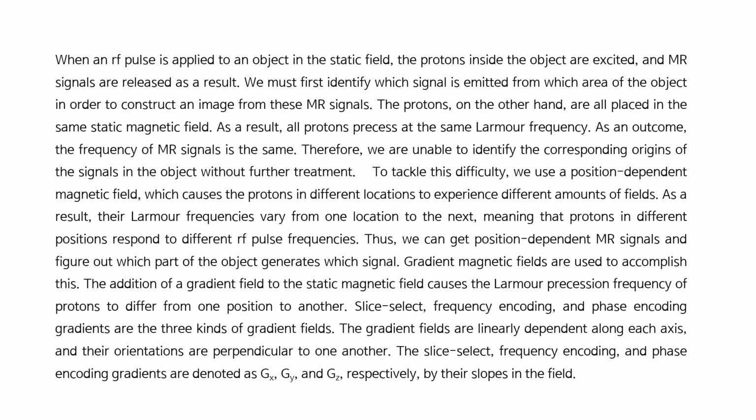When an RF pulse is applied to an object in the static field, the protons inside the object are excited, and MR signals are released as a result. We must first identify which signal is emitted from which area of the object in order to construct an image from these MR signals.